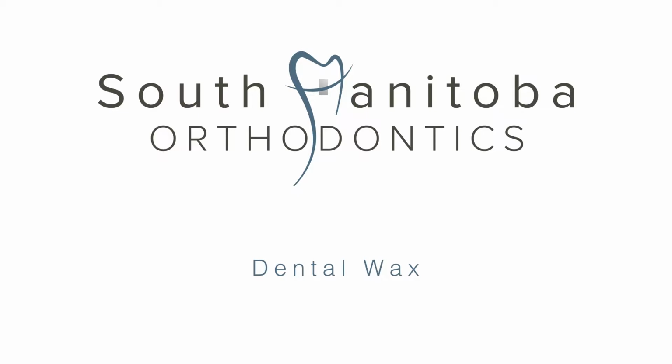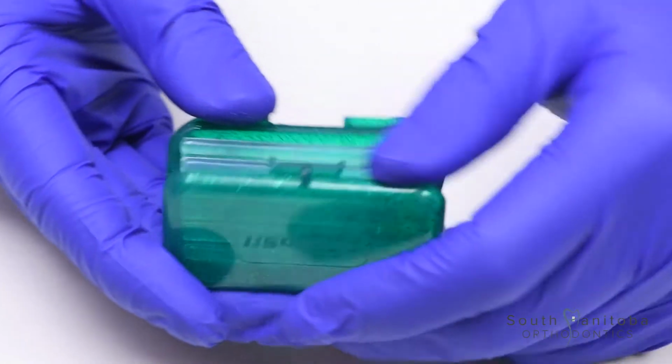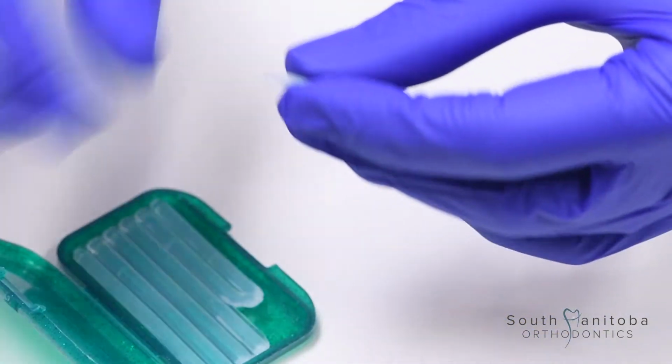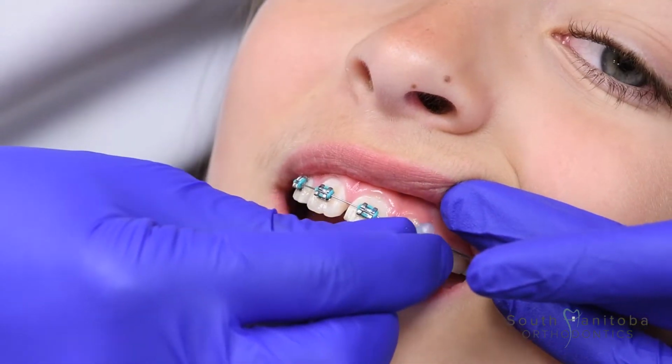As you're getting used to your braces, you might feel some sore spots on the inside of your cheeks and lips. And if you do, you can use orthodontic wax to cover the area that's bothering you. Just pinch off a small piece of wax and soften it by rolling it between your fingers. Then just place the wax over the spot that's bothering you.